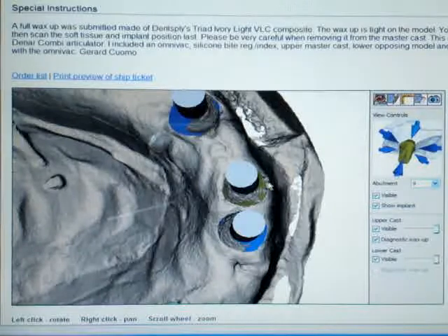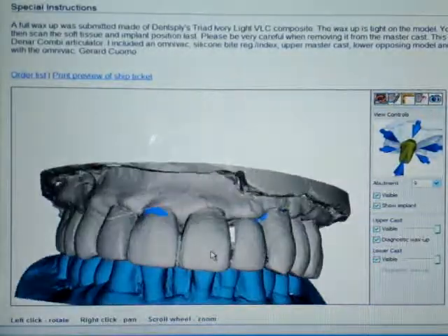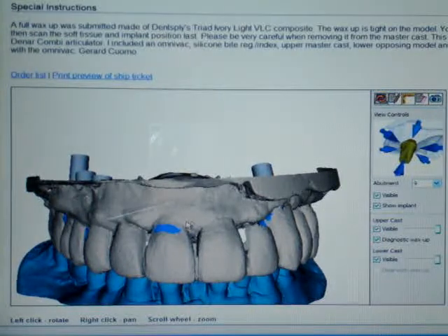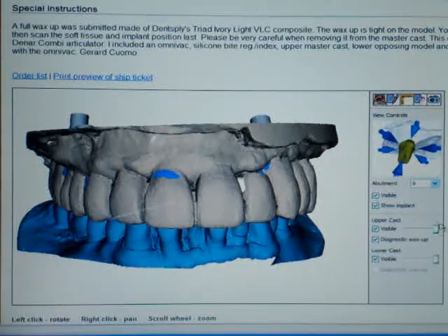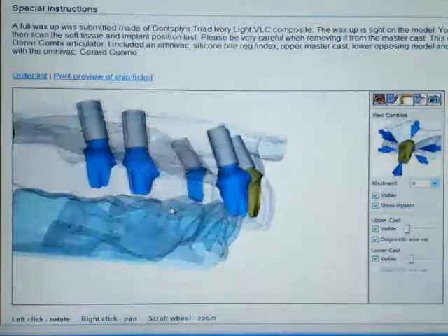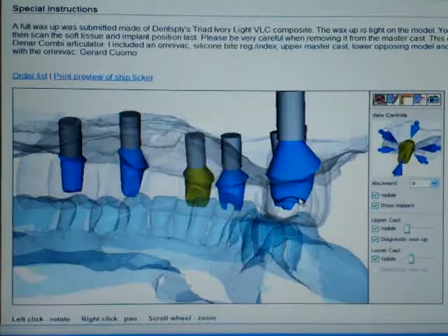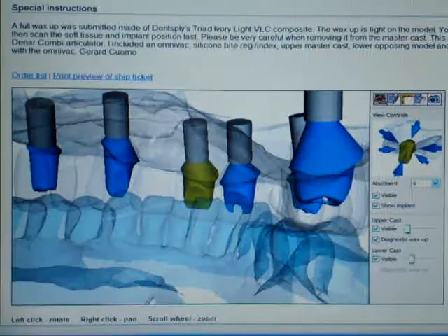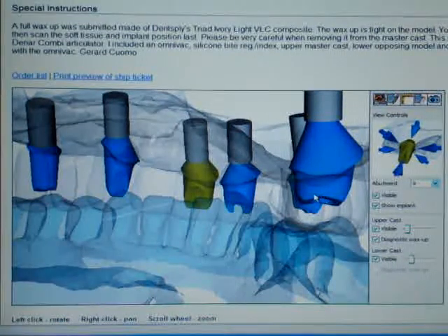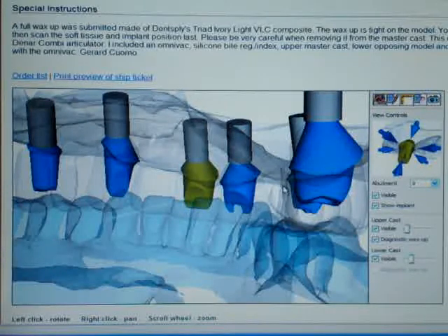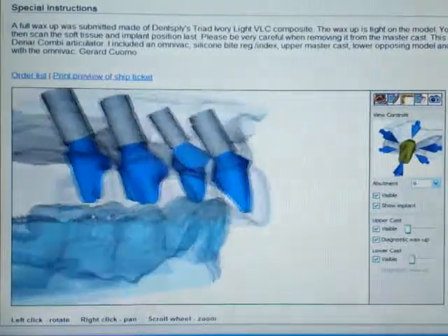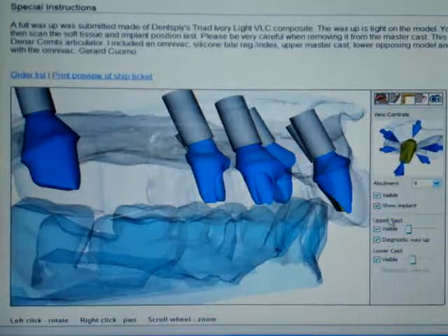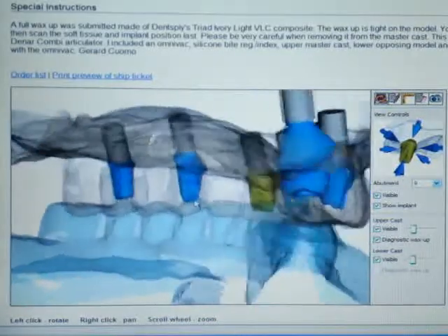Let me just scroll down here. There we go. Great. There. It takes a little getting used to the software, but it's pretty easy. Let me make that point here. So push this back. Push the lower back. You want to be able to make sure that you've got a corridor to follow down this distal to, I want to say, posterior to anterior corridor. I can pan this over. I'm going to wait. Computer's a little slow. Here we go. So by panning, see, you can check here mesial-distal dimensions.